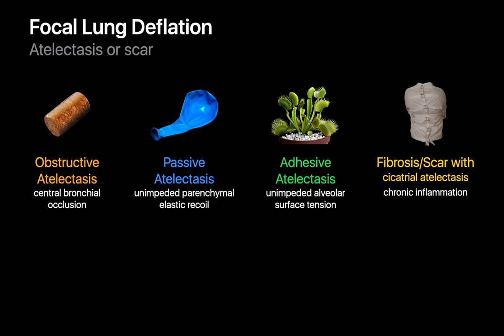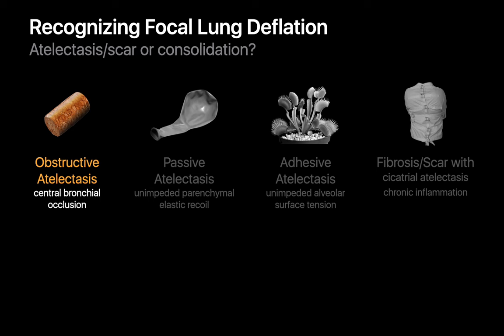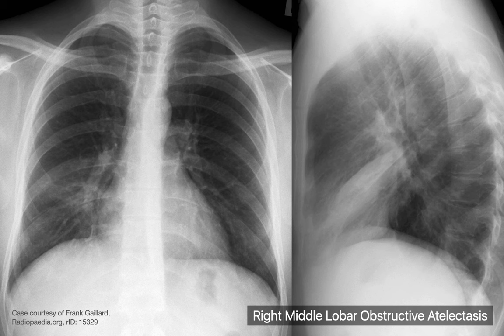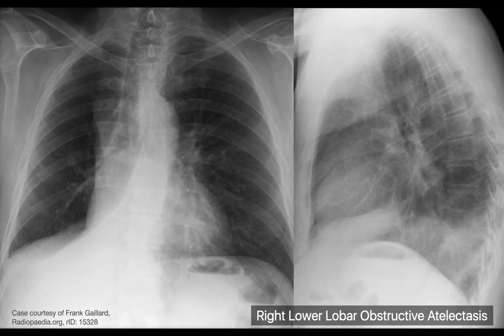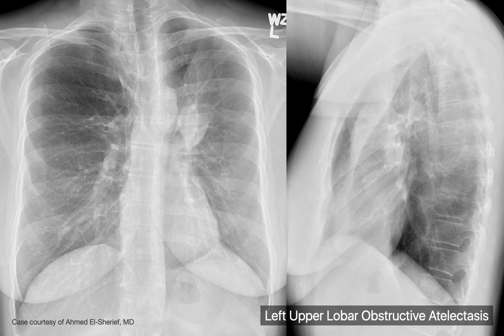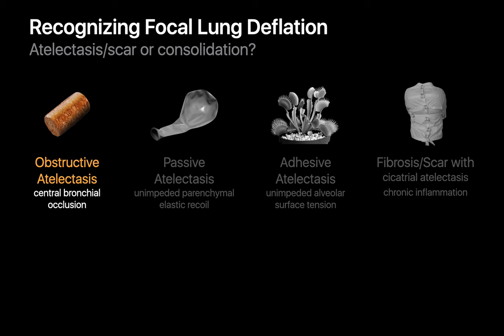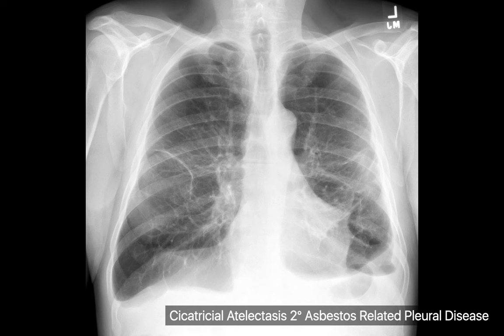The customary appearance of focal lung deflation in obstructive atelectasis is probably the most reliably recognized on chest x-rays, taking one of five familiar patterns: right upper lobe, right middle lobe, right lower lobe, left upper lobe, and left lower lobe collapse patterns. Cicatricial atelectasis and scar can also be relatively reliably recognized, often appearing as dense linear bands or wedge-shaped opacities with local architectural retraction, such as the linear bands in this patient with asbestos-related pleural disease.